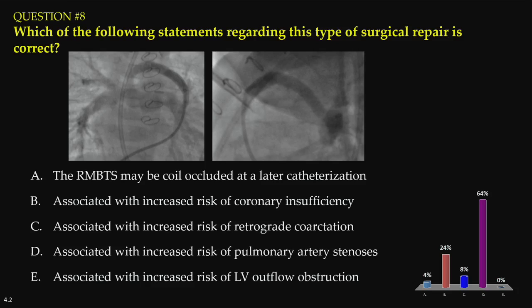So first of all, what does this show? The catheter is coming up from the right side. It looks like it's coming up the IVC into the RA, RV, and then through something that's pretty uniform and small in diameter that is really anterior and then connects into the pulmonary arteries. Okay, so what is this showing? It is showing a Sano. It is showing an RV to PA conduit.